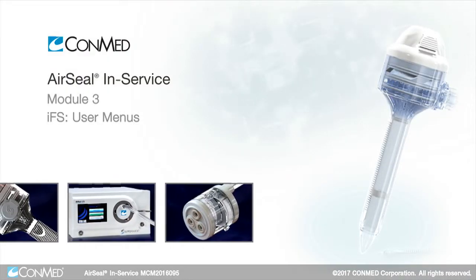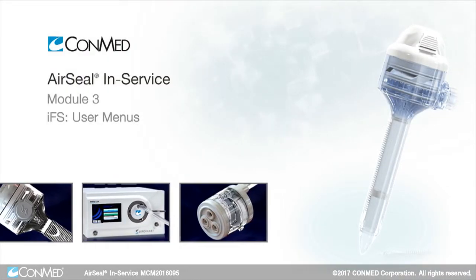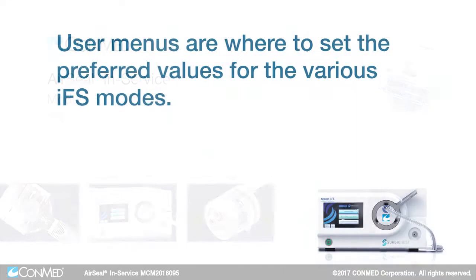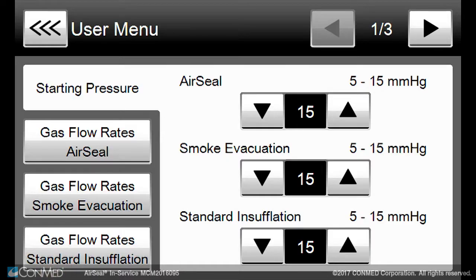The IFS touch screen displays the user menus. This is where to set the preferred values for the various IFS modes. From the home screen, touch the menu button.